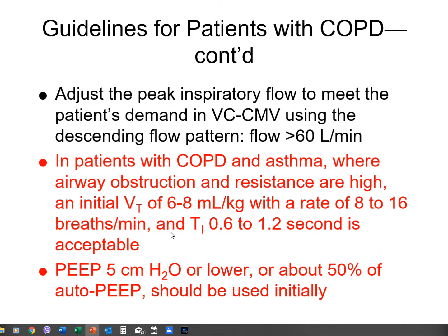Last but not least, PEEP you want at +5 or lower, or about 50% of auto PEEP should be used initially. Now, I'm not sure about the 50% auto PEEP, because if they're auto PEEPing at 10, then I would have to set my PEEP at 5, right? So they're going to have to breathe 5 centimeters of water pressure on top of that, with sensitivity at, let's say, -1, so they're going to have to breathe 6 centimeters of water pressure.